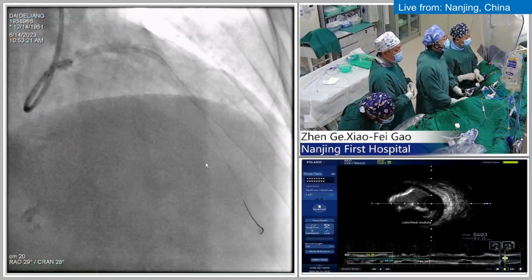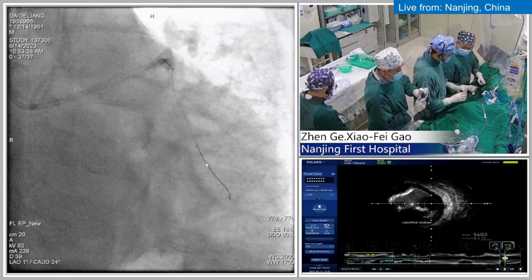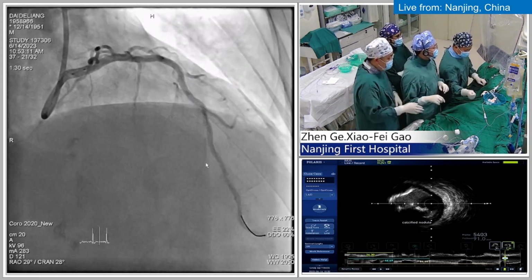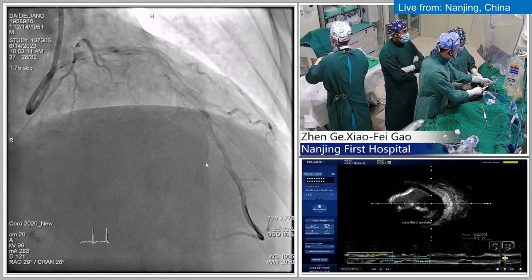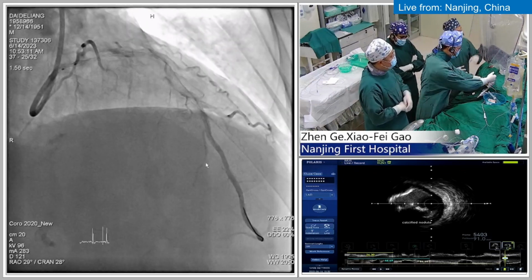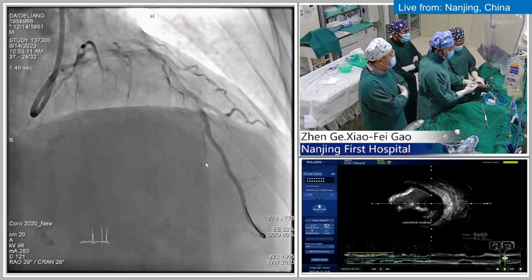What methods do you use to assess the adequacy of stent deployment? All image guided. What has been your further progress in this case? Anything you have changed from your initial plans? If the circumflex ostium is compromised, probably we use the kissing balloon technique. But from this angiogram, I think the ostium is good.